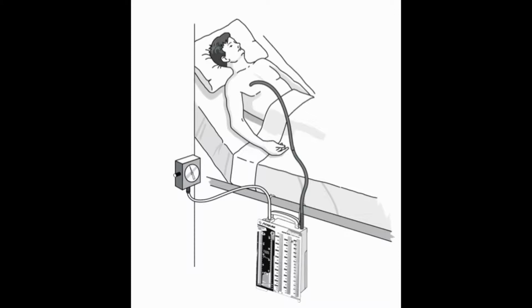So chest drains are used to facilitate the drainage of fluid from the pleural cavity by using a one-way valve that prevents the backflow of fluid back through into the chest. It's most often used for us.